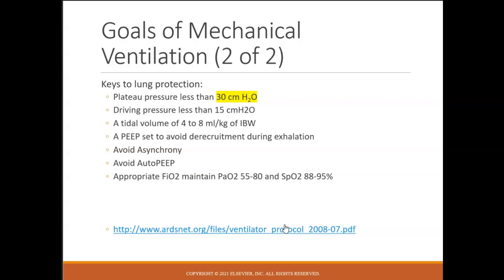But I feel like the big takeaway with this is not trying to memorize these ranges and be super fastidious about sticking within them, but more just being cognizant of the fact that under oxygenation is bad, but so is over oxygenation. So we don't want to have either. So, we talked a lot about setting the FiO2 initially to 100%, and I'm sticking to that recommendation unless there's something in the patient's history that says you can do less. But it is important to be weaning those FiO2s rapidly.